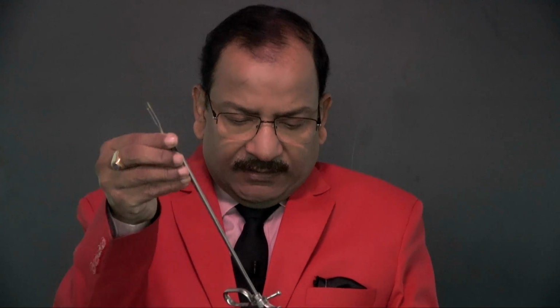Once it has entered inside, you will fix it, and you will check that it is moving. Yes, see, it is moving. So the electrode is attached to the working element, and check it like this. Remember, without pressing this knob, don't try to push the electrode, it will break.